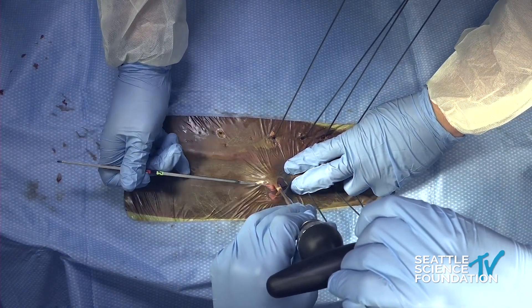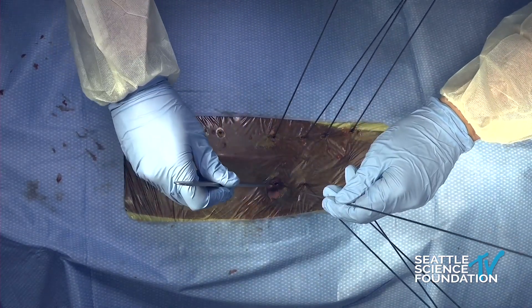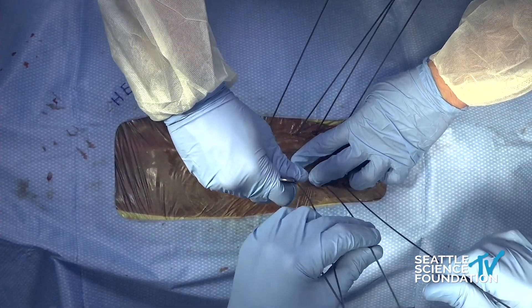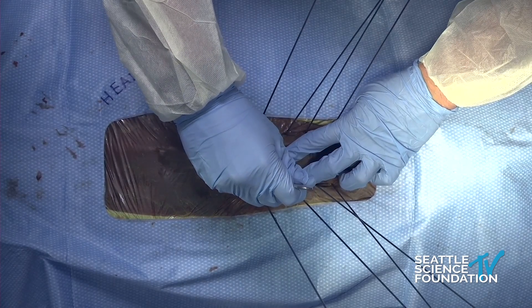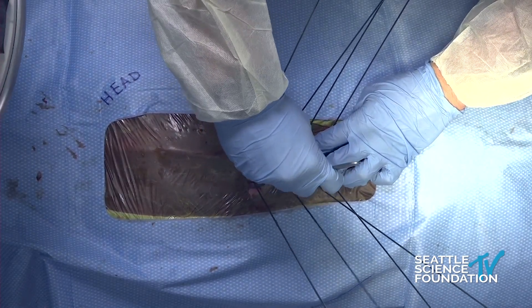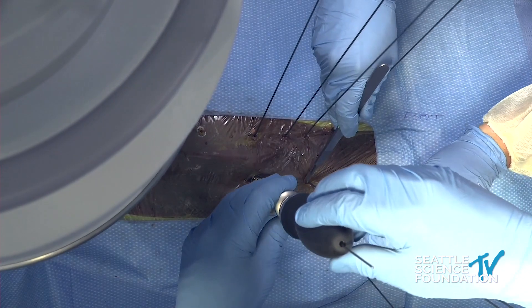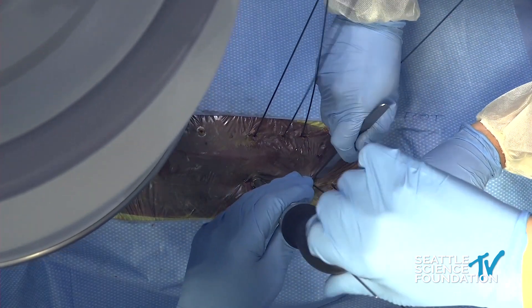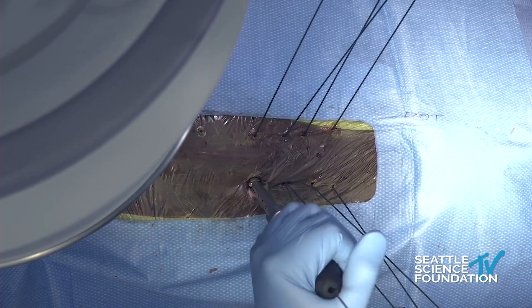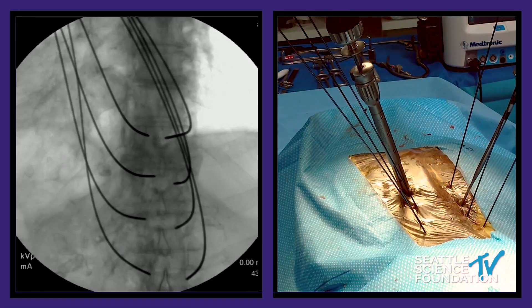There are several ways to do this. I personally like making the incision in the midline, preserving the fascia, and then closing the skin incision back up — I think it heals better. But we went ahead and did it this way. Come on in, Victor, and let's go ahead and thread a screw and put it in. I just tapped that and now I'm putting in the screw. Mauricio, were you able to tap your side?